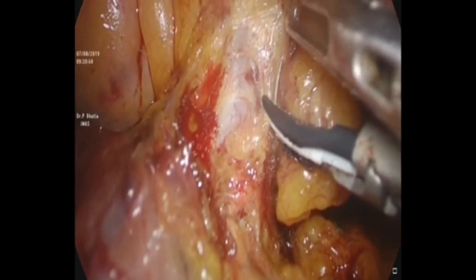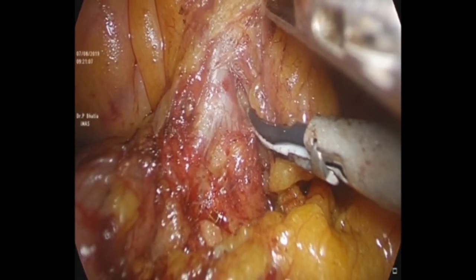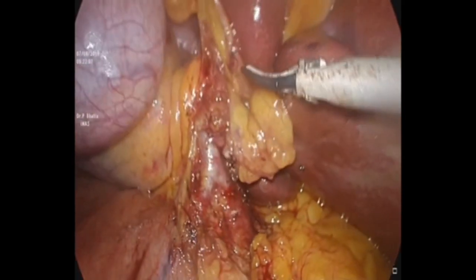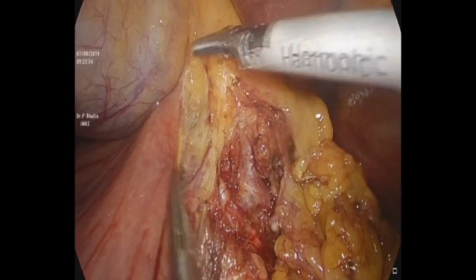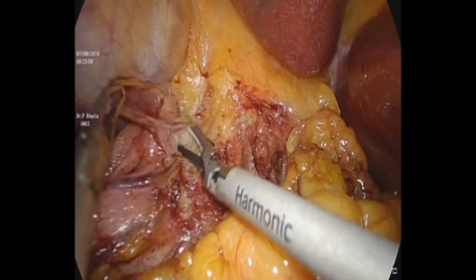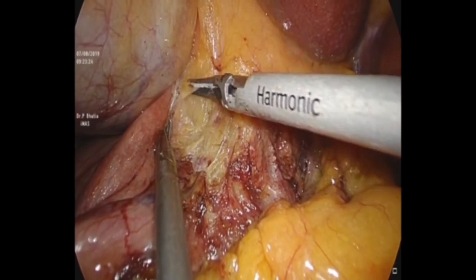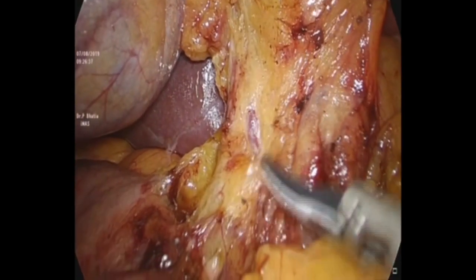The first dissection is done close to the hepatic artery. In this situation, one can visualize the common hepatic artery and the gastroduodenal artery. As we do the dissection in the supraduodenal and suprapancreatic area, taking care of all the fibro-fatty tissue, one should try not to injure any vascular or ductal structures.